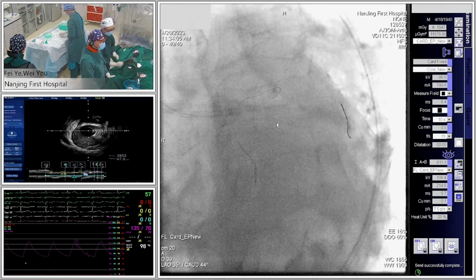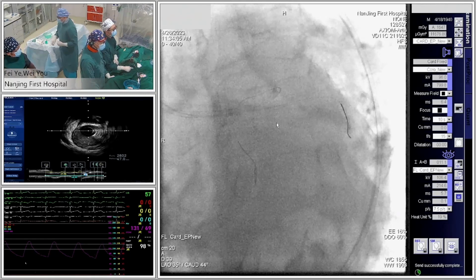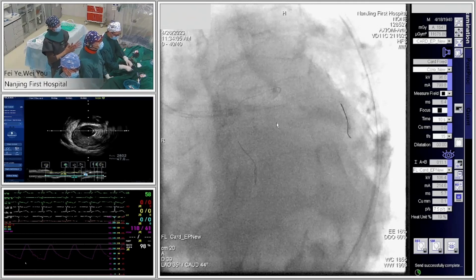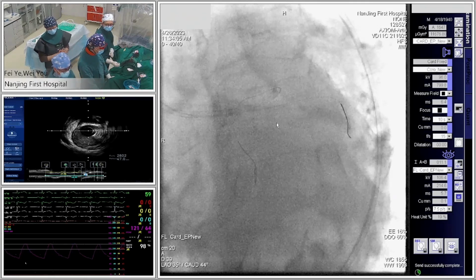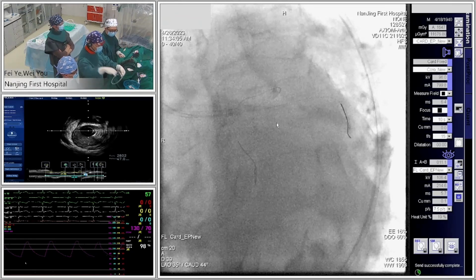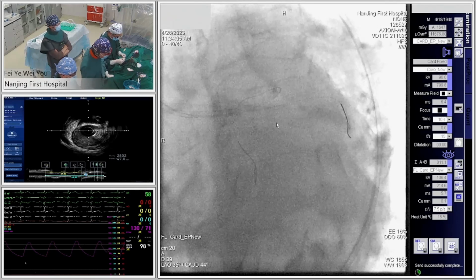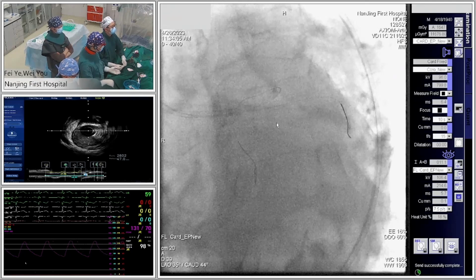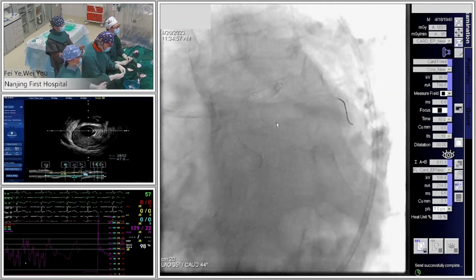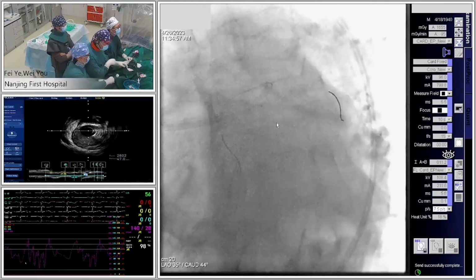4.0 POT balloon. This kind of POT balloon was designed by Dr. Shaoliang Chen, with a very short length and a very short shoulder. It's precise, just according to the IVUS finding. It's very useful to perform a POT and perform the precise crush. For the first crush we use 1-to-1 according to the proximal part of the LAD, so the POT balloon shoulder cannot cross over to the carina. It's very important to avoid more carina shift.